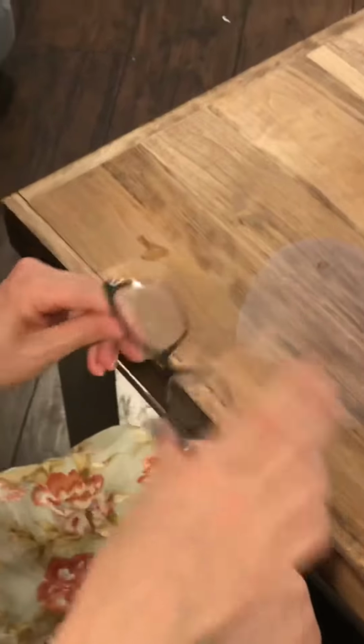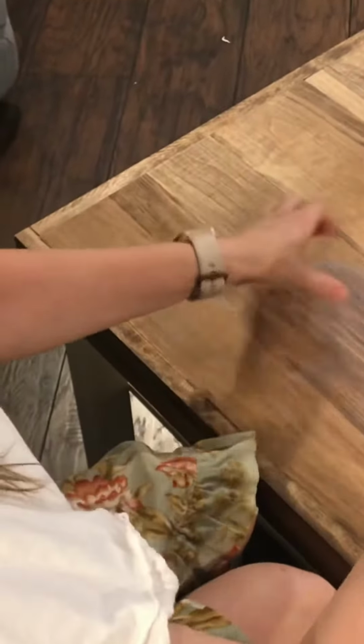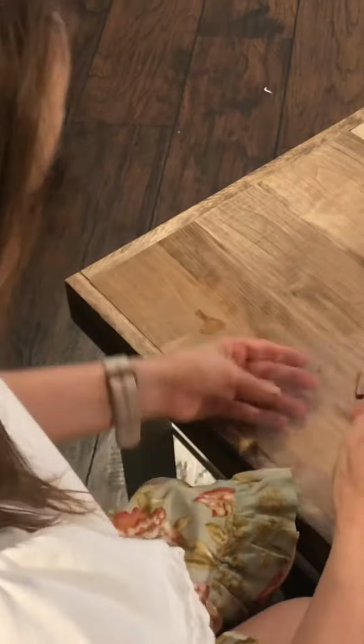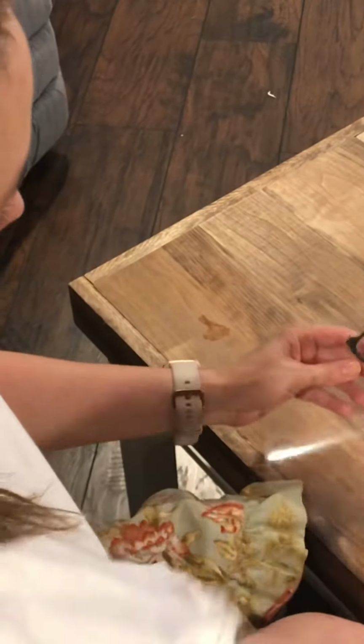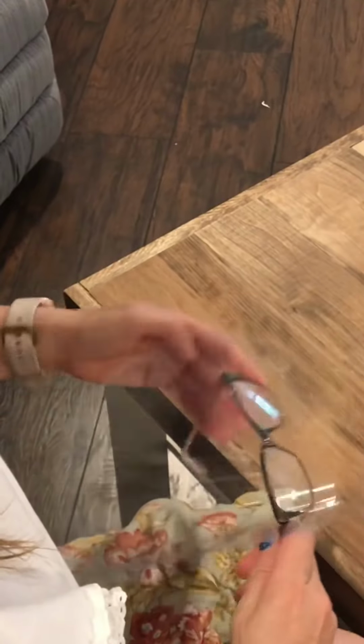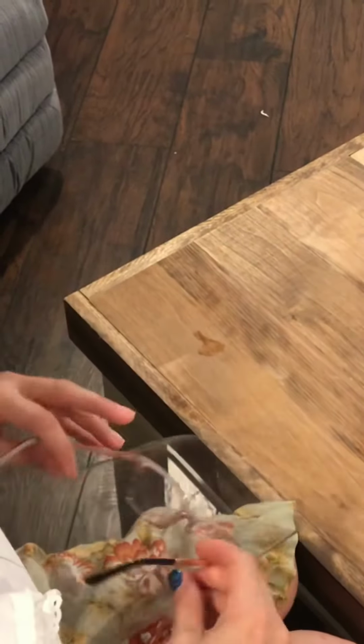Okay, then I'm going to splice in a video that shows how to get it onto your glasses. Okay, you ready? So the glasses are like upside down, and you're going to put the earpieces in, and it's going to bend and make a little U shape, and slide it all the way down to the lens, and then you can flip the glasses to the front.